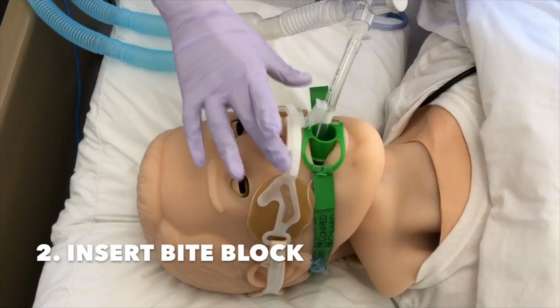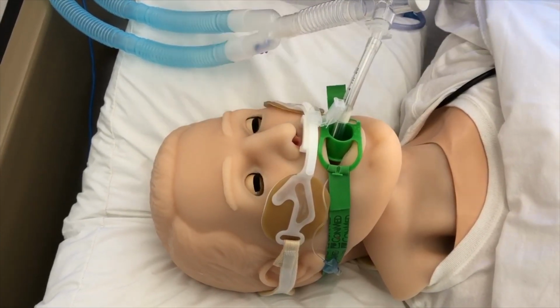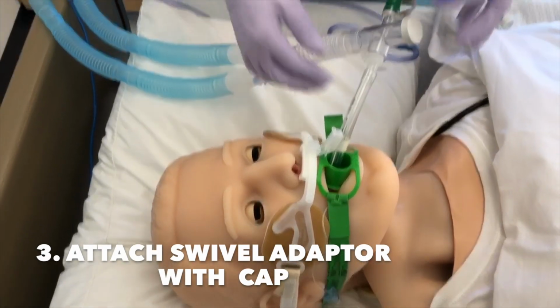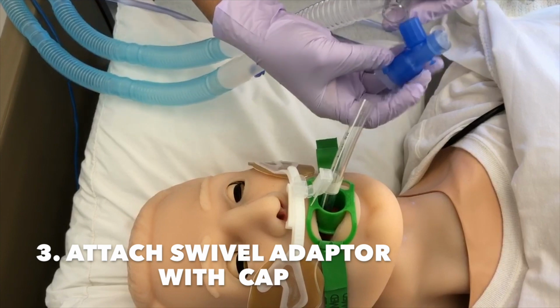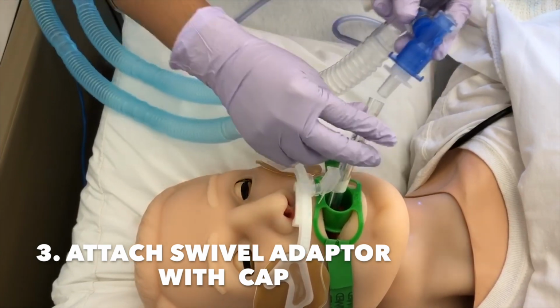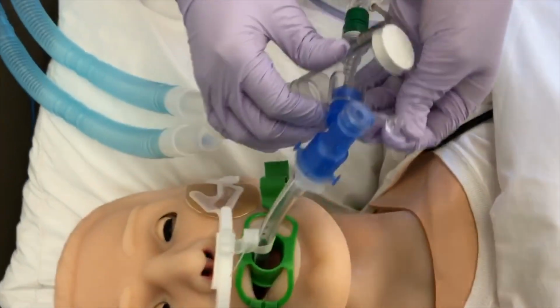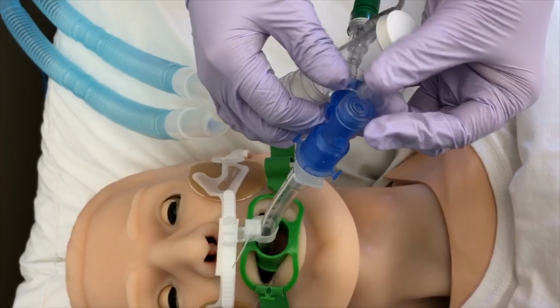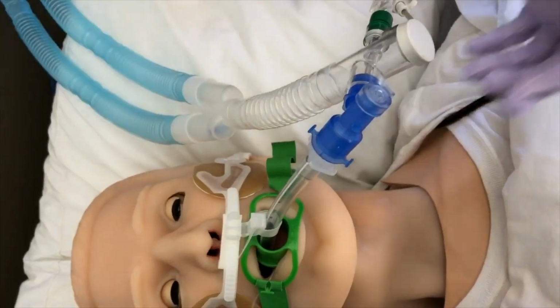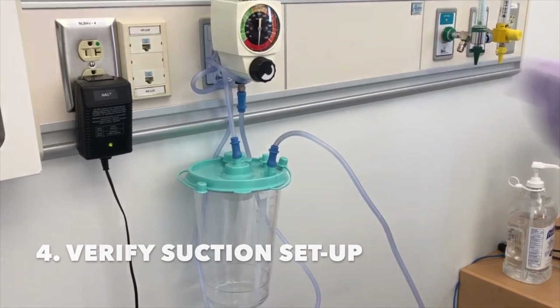So as I mentioned earlier, we have to insert the bite block to protect the scope and the tube, and we have to attach the swivel adapter between the tube and the ventilator, and this is the scope insertion port. You have to make sure that the suction is set up and set at max pressure.